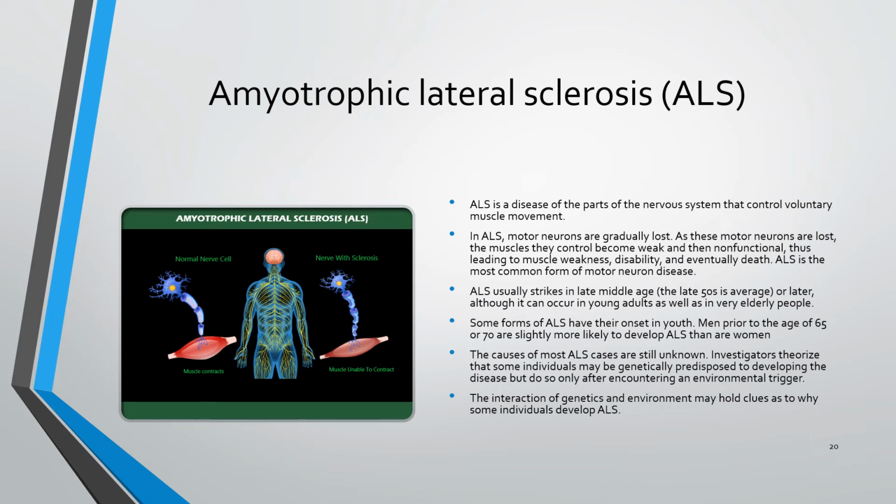So when you have ALS, the key point is that you might have to support ventilation, eventually with non-invasive ventilation. Another concern with these patients is what is the most common pulmonary function test? Typically it's a forced vital capacity. More people do forced vital capacity measurements with ALS than any other pulmonary function test. Why, I don't know, especially with the evidence I've shown before, where the MIP and MEP are great predictors. But with ALS, the typical test you get is a forced vital capacity.